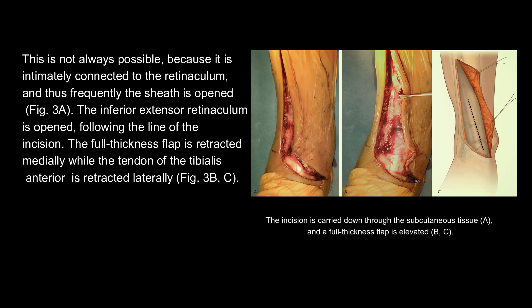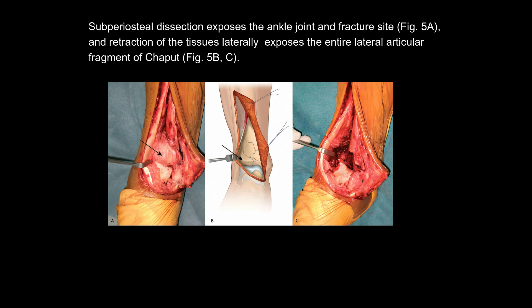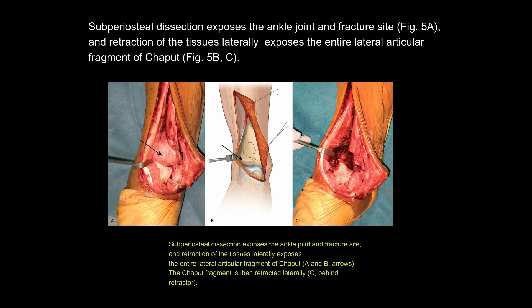The full thickness flap is retracted medially while the tendon of the tibialis anterior is retracted laterally. The flap is handled atraumatically without strong retraction or use of forceps, frequently using nylon sutures in the skin to apply traction. At the level of the ankle joint, the articular capsule is opened longitudinally, exposing the talus. Subperiosteal dissection exposes the ankle joint and fracture site, and retraction of the tissues laterally exposes the entire lateral articular fragment of Chaput.